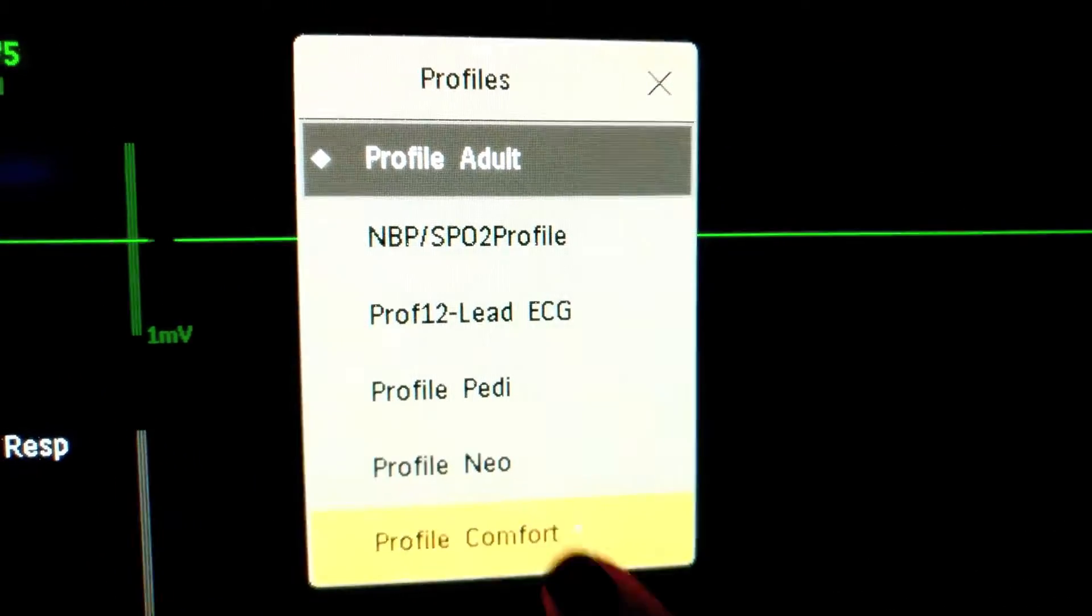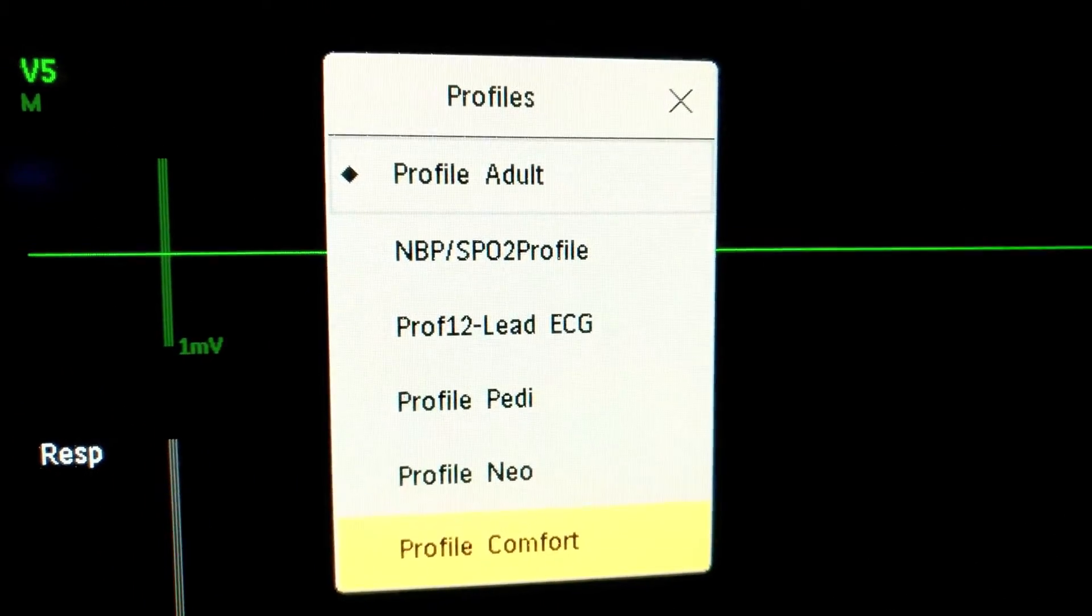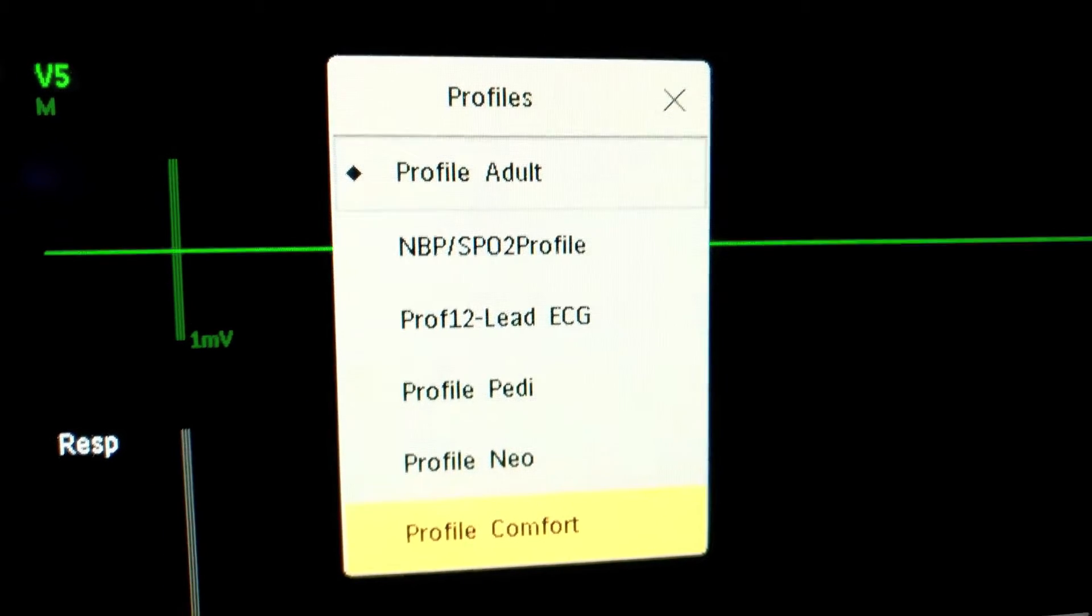First thing you'll want to do is click or touch the words profile adult in the top right hand corner of the monitor. From there a menu will pop up. Select profile comfort on the menu and hit the confirm button at the bottom.